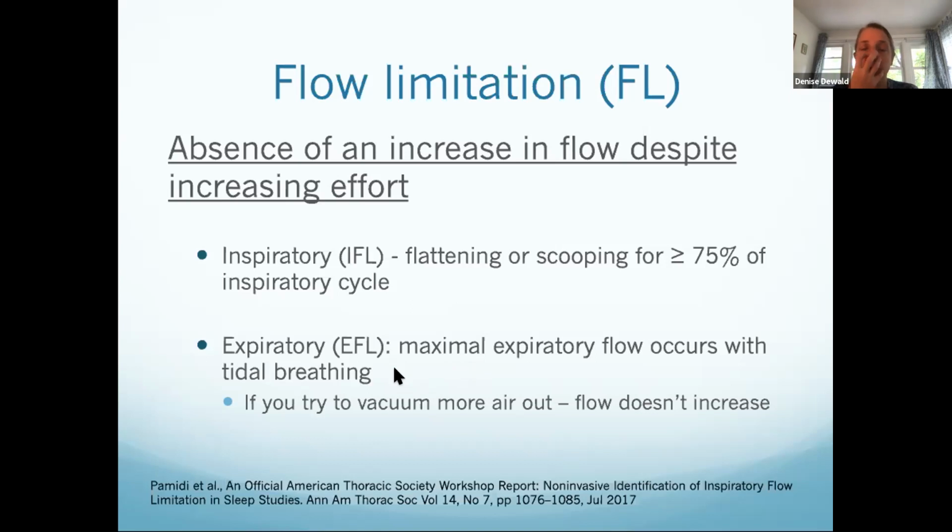But basically, if you put your CPAP mask on and try to vacuum out air, more air doesn't come out. So you can't increase the flow with the vacuum, basically. All right.